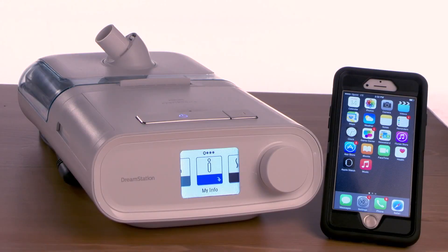This video will take you through the steps to pair your mobile device with your DreamStation sleep therapy system.